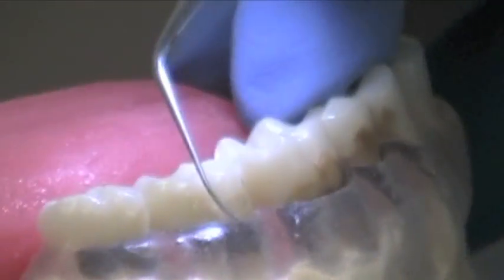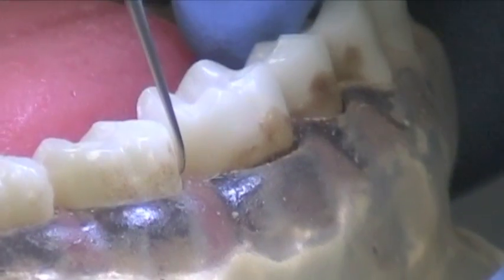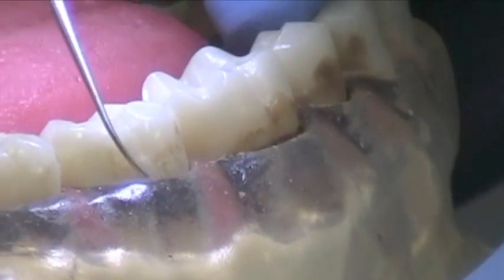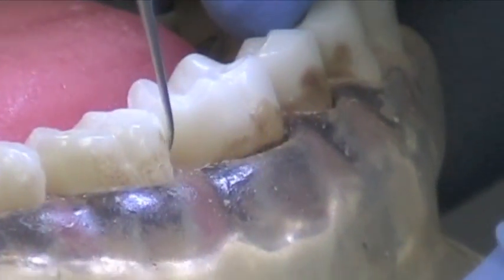Transitioning to the back, you can see how we can use this tip on the buccal and then roll right into the mesial. This tip will remove grainy calculus. It's very great for periodontal maintenance patients and even healthy patients.